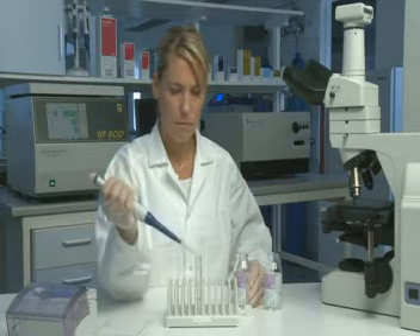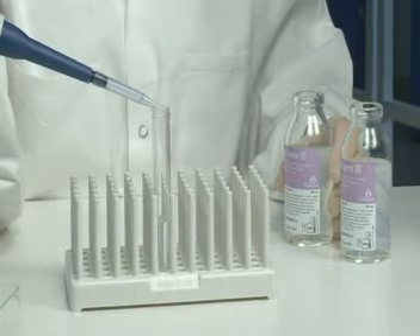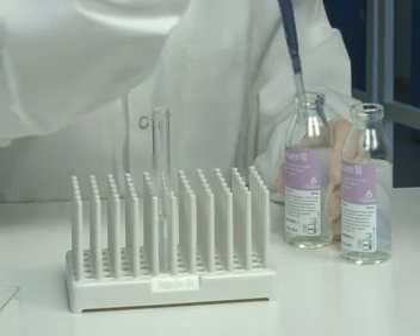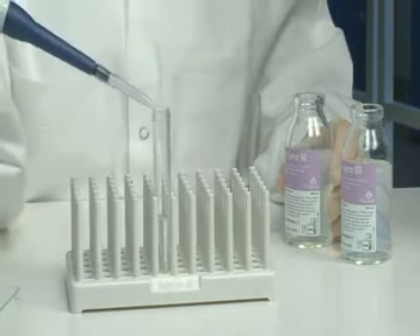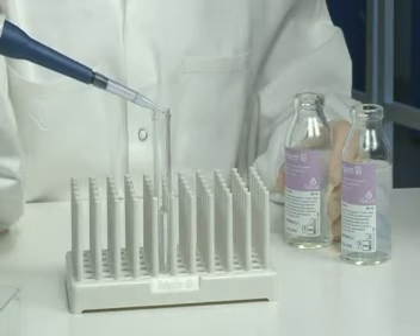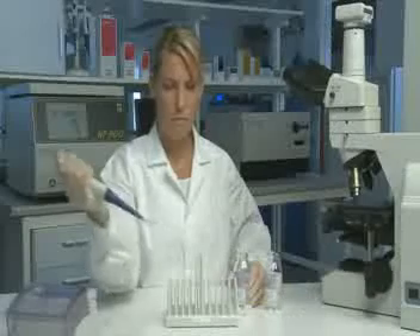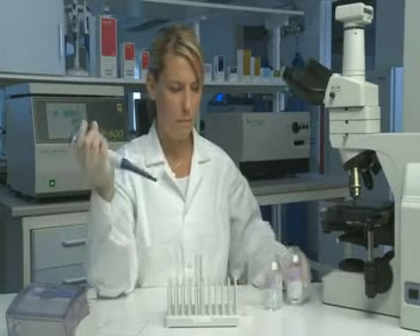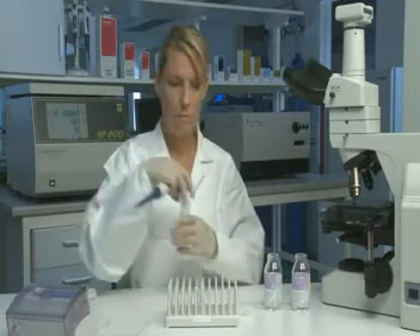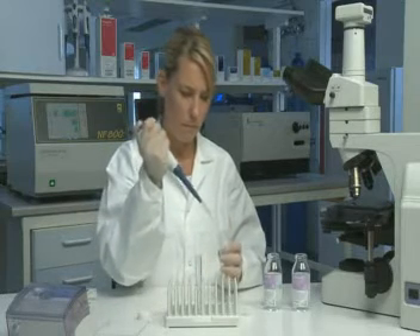Make sure not to disrupt the layers, creating a sharp interface between them. Apply the ejaculate over the PureSperm 40.